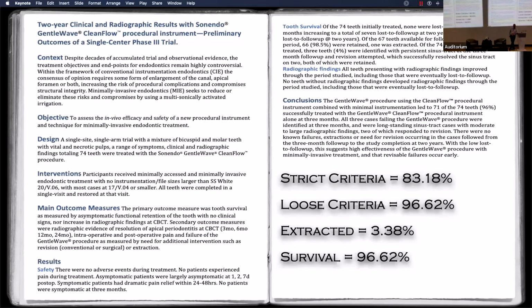John, do you have any file changes when you are right on top of the mandibular canal? And do you have any concern about sealer puffs? I think everybody does, and that's independent of file design. I used to be more worried with molars.